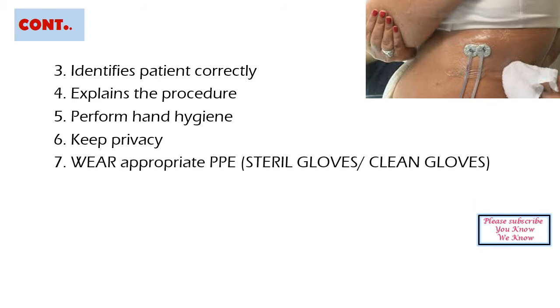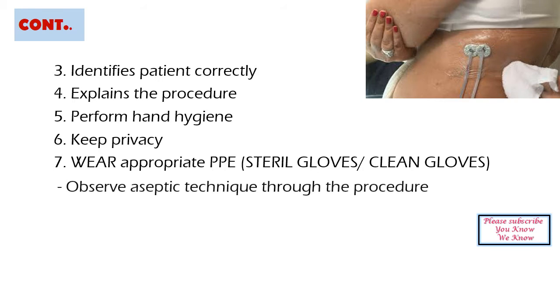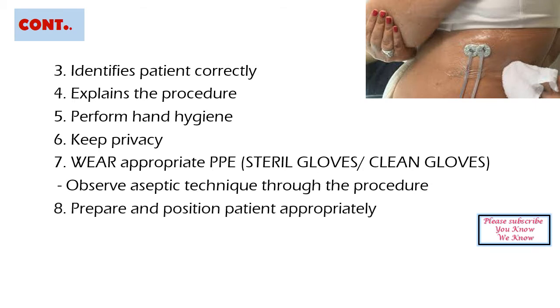Wear appropriate personal protective equipment, the sterile gloves and the clean gloves. Observe aseptic techniques throughout the procedure to prevent infection to the patient. Prepare and position the patient appropriately depending upon the site of the tube inserted.